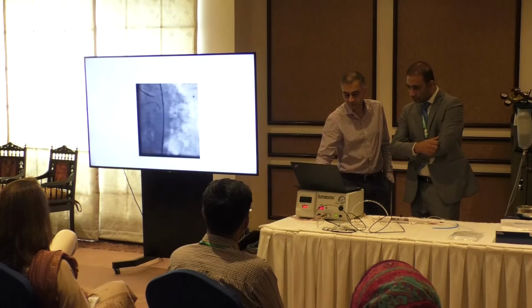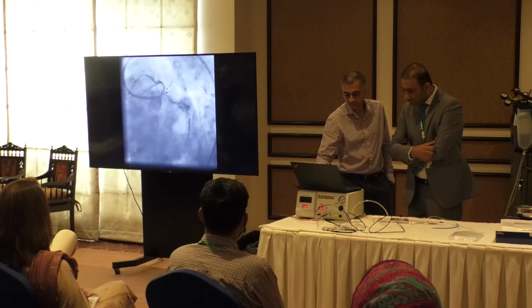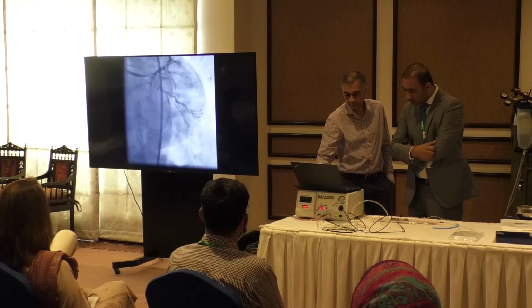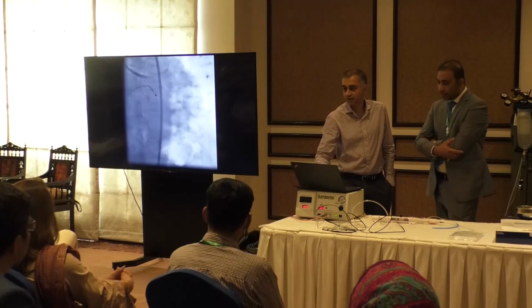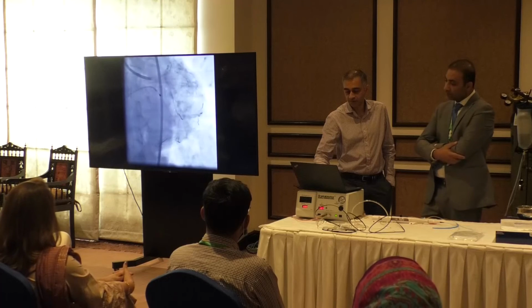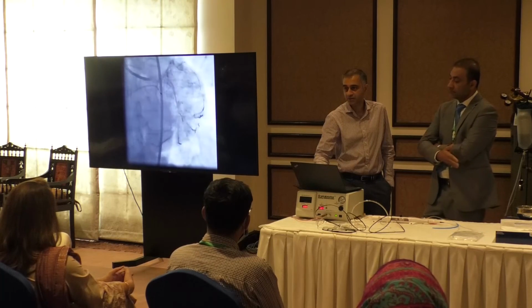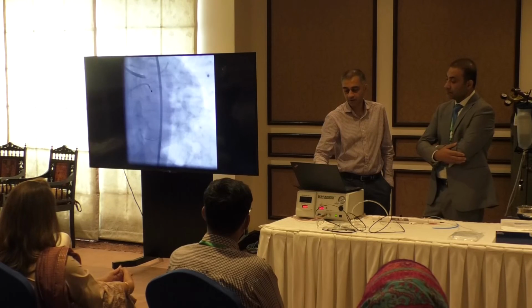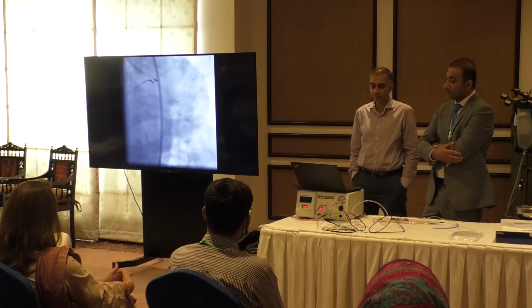Just have a look and see that video once again. It's quite nice, isn't it? So here, the other thing you spot is the temporary pacing wire. I have to say, in my practice, I've pretty much moved away from putting a temporary pacing wire in patients, although the company will still recommend that, particularly in the right coronary artery.